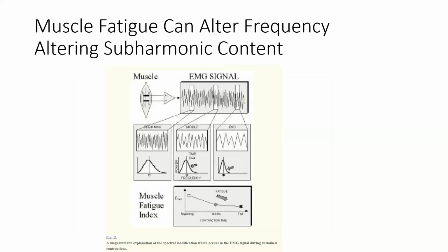And as we said, muscle fatigue. Here's a muscle fatigue. There's an initial EMG. The signal starts to degrade, less and less firing. The frequency drops down, less firing, the frequency drops further. And so it's a shifting pattern.